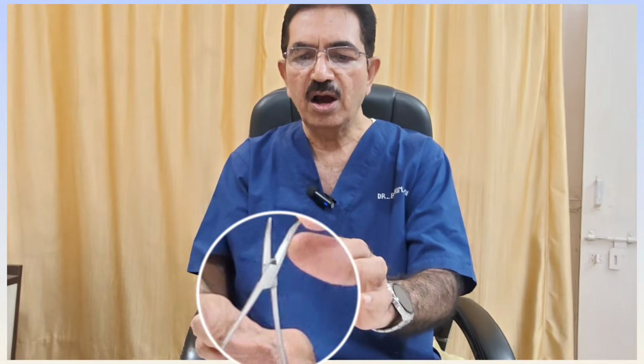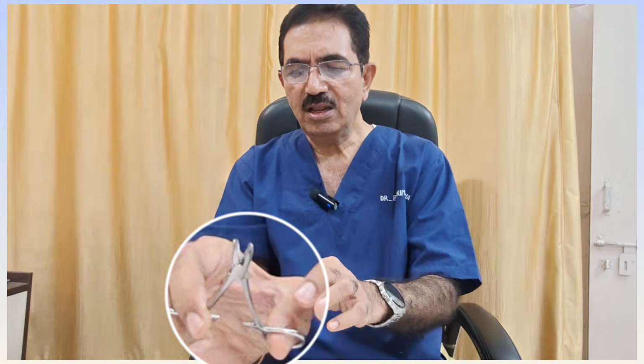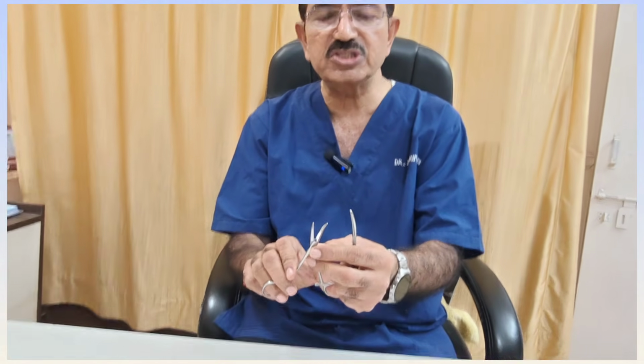Now the third question's answer: what are the parts of the instrument. I will describe the parts of the instrument: blade, box type of joint, handle, finger bow and catches. Suppose this is a scissor; in this instrument, this is a simple type of joint. The examiner may ask what is the advantage of the box type of joint. It gives stability to the instrument. That is the reply regarding the parts of the instrument.